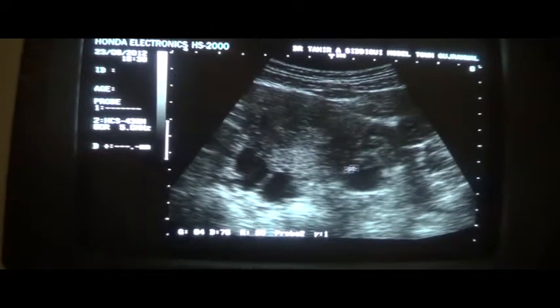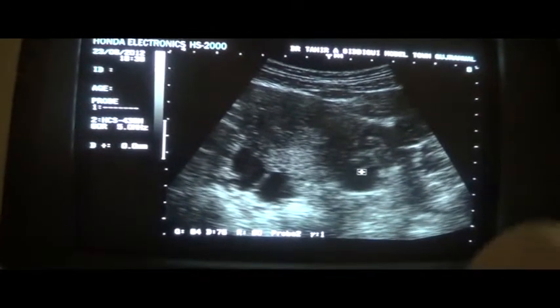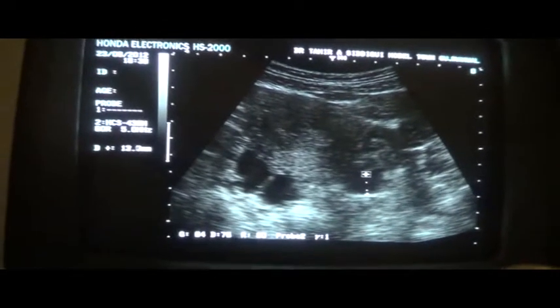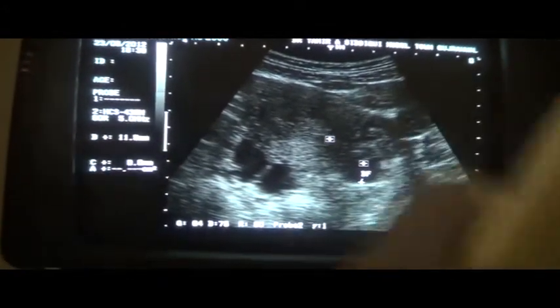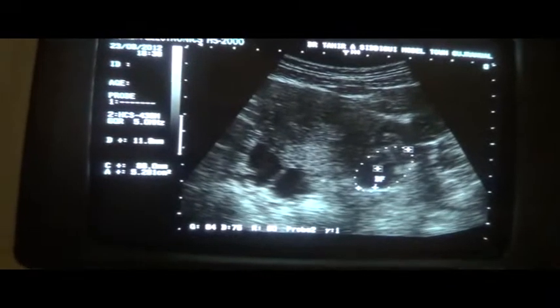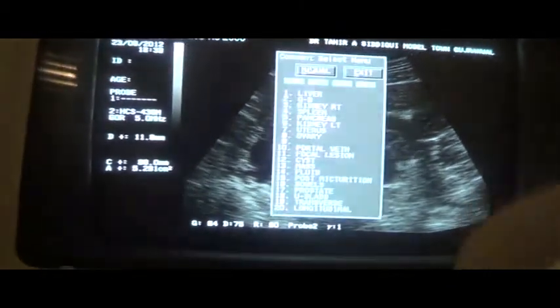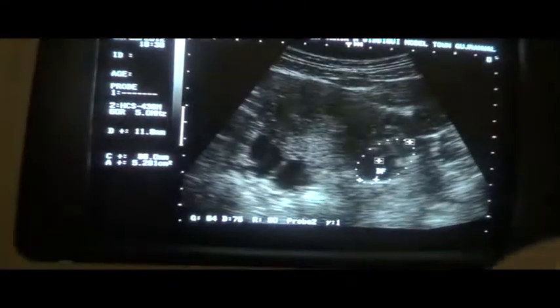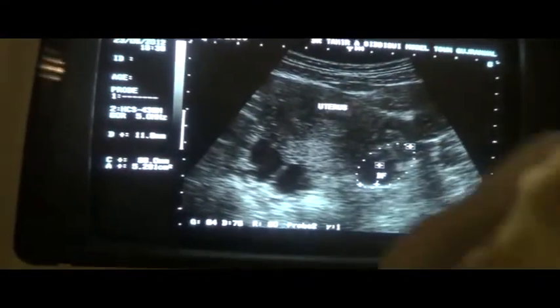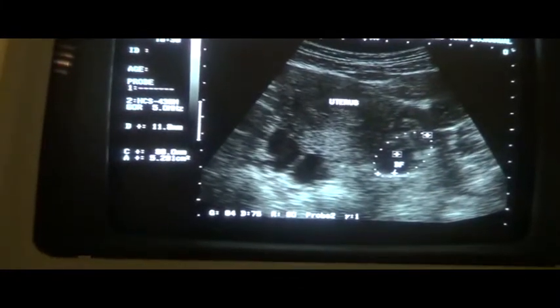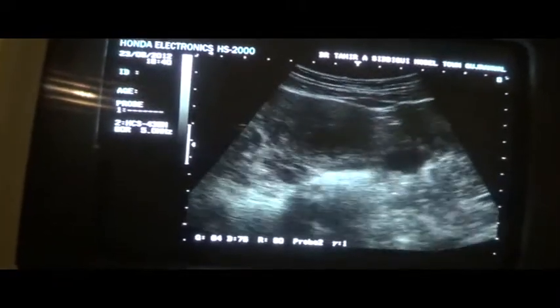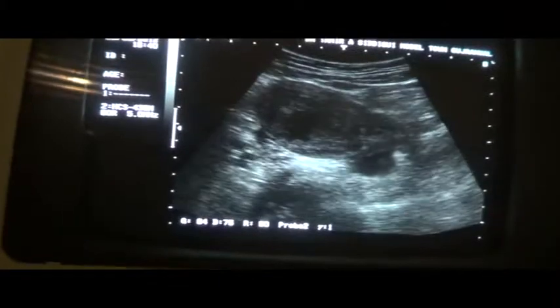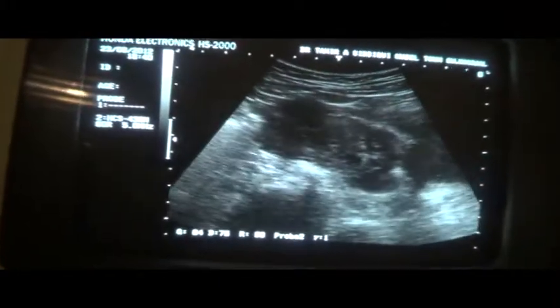This is the left ovary. Here you can see this is the dominant follicle in the left ovary. This is the ovary and this is the uterus in transverse section. The central echogenic area is that of the endometrial canal. We have seen the urinary bladder, the uterus in longitudinal and transverse views, the left adnexa, the left ovary, and the dominant follicle.